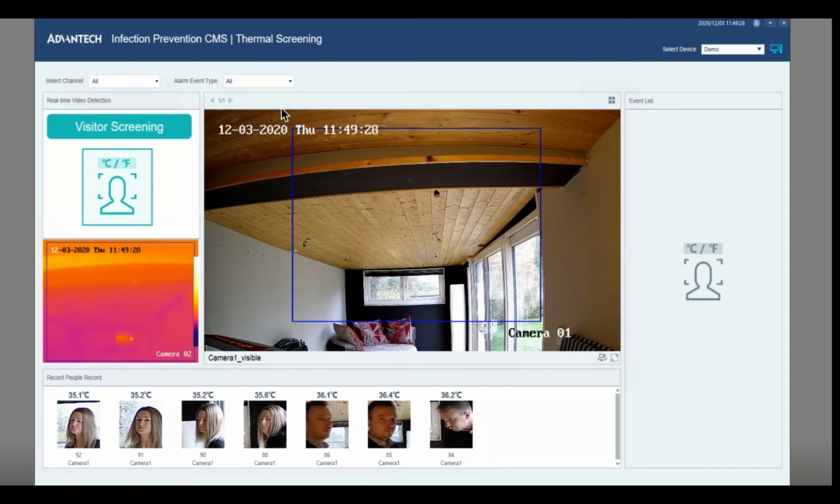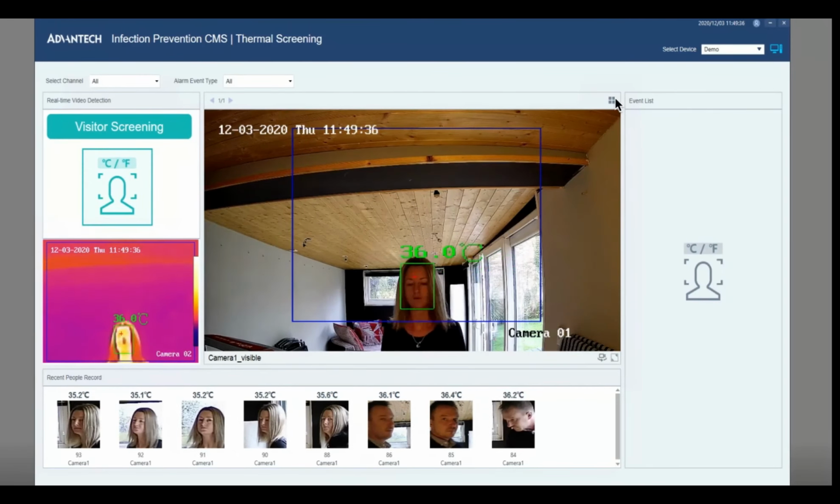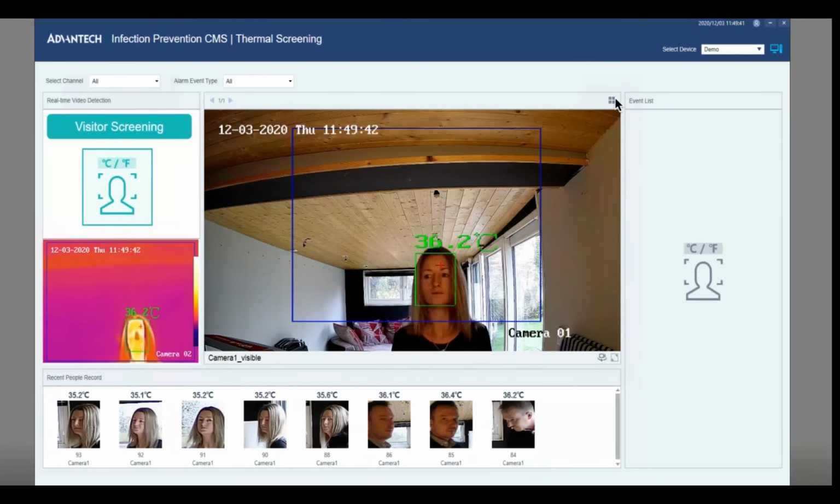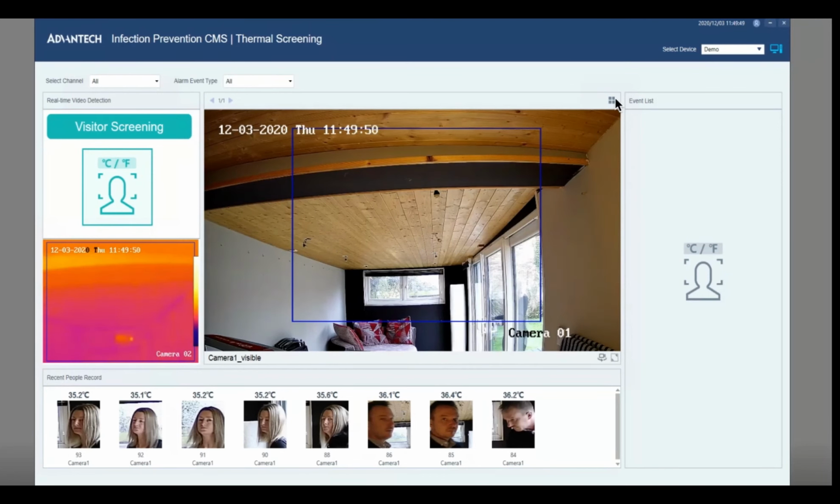If I just drive here, we can see where we can have up to 4 cameras. I'm just showing the thermal on the left as you'd mentioned it. There you go. And the camera itself, all cameras have the sweet spot where they are accurate within that 0.5 or 0.3 degree. 10 meters away or 5 meters away in this scenario, it's a bit less accurate, because this camera is set up for accuracy between 1 and 4 meters. So that's why you see the temperature changes as Vicky approaches the camera. So that's an important consideration when sighting.